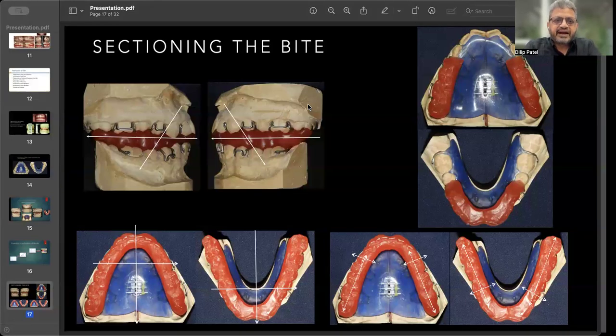Now, how is the inclination transferred over the bite block? On the lateral position, you can see it is almost 70 degrees to the occlusal plane. The inclination in the upper plate starts either between the canine and premolar, and terminates into the lower before the first molar starts.